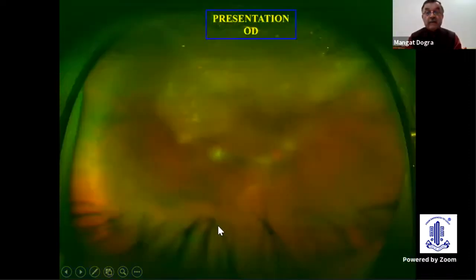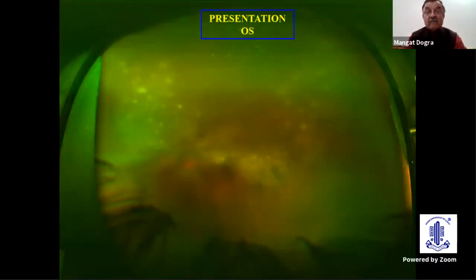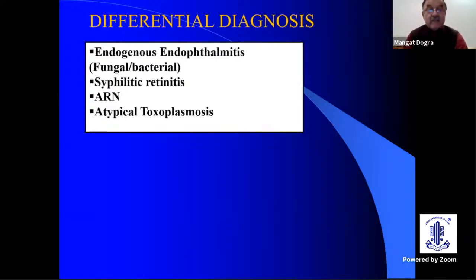You can see the photograph here. This is the right eye. You can see these lesions all going all the way to the periphery, and these subretinal lesions, and you can't make out what they are. They are bilateral. This is the other eye, with tiny deposits of different sizes. So what are we dealing with here? Is it endogenous endophthalmitis, even syphilitic, or atypical toxoplasmosis, of course.